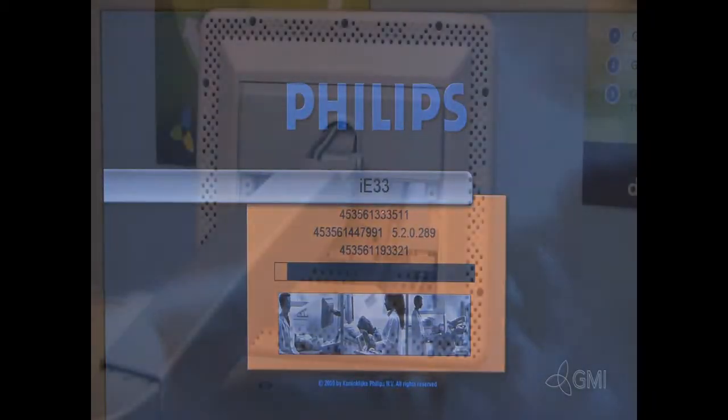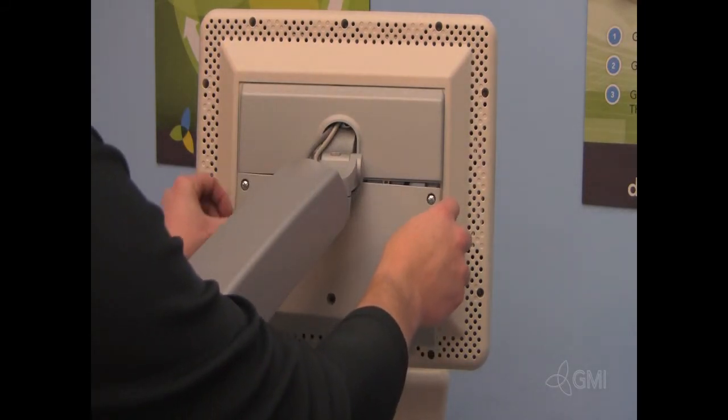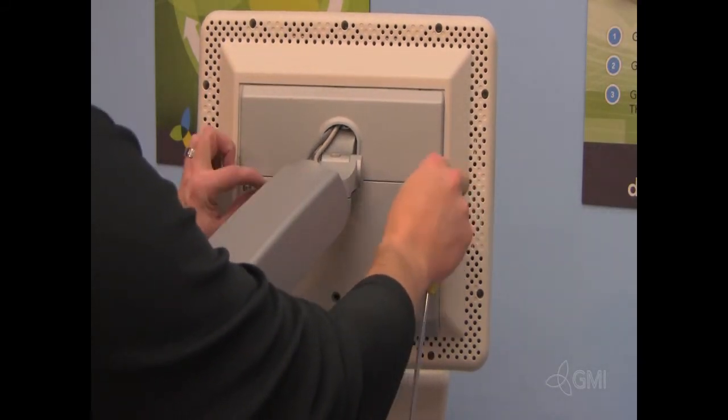The system will then restart. Install the lower monitor panel and replace the three screws.